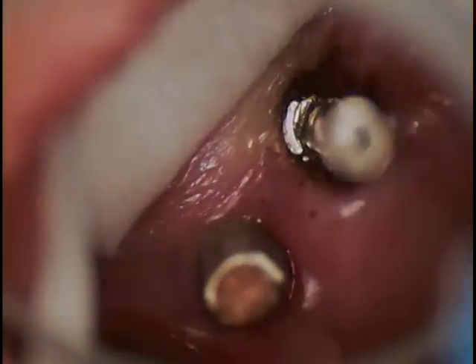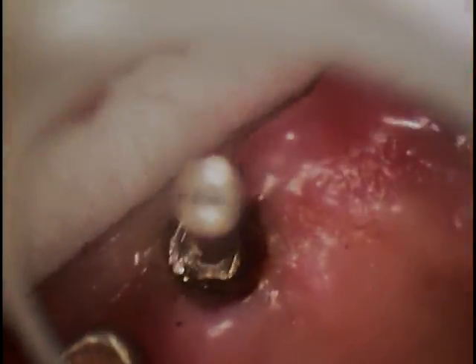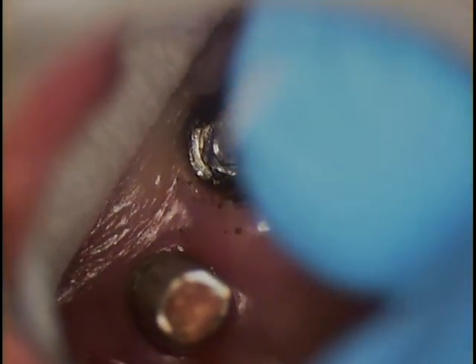Go back in with our threader again. It tightens to a certain point, and that's it. It engages really well, so that's good. I think we've got to be really happy with our result today.